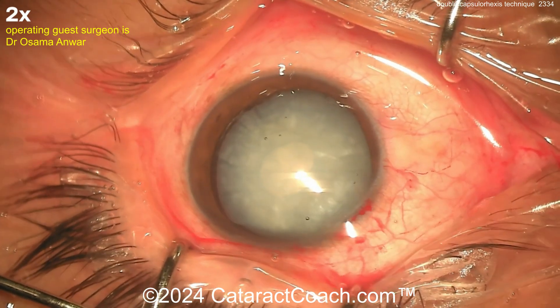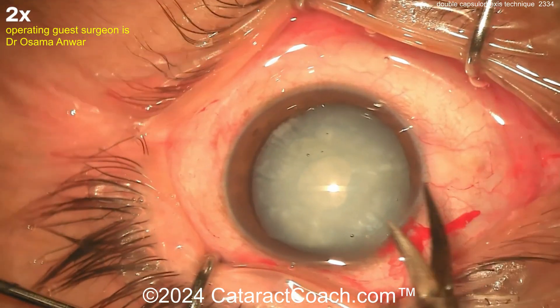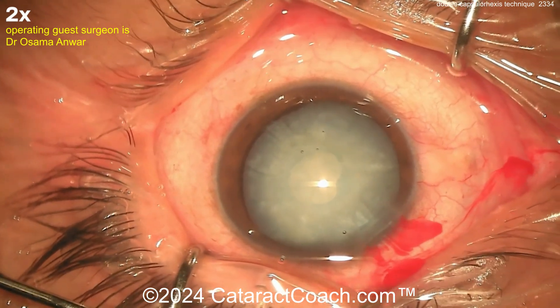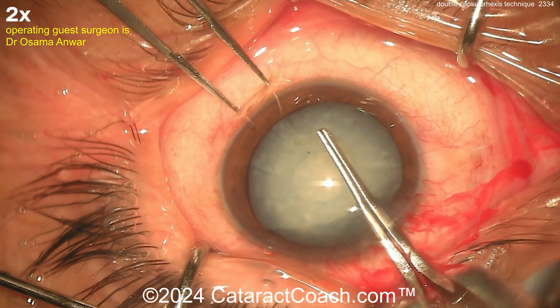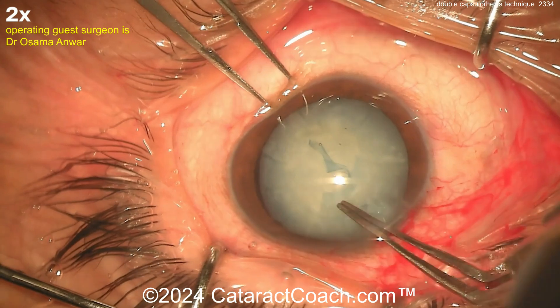Now you can put more viscoelastic in the eye, nick that, and start to get your big rhexis done. Using just the blade to widen up the incision a little bit, then using scissors — a little cut in the capsule. Now create your full-size ideal capsular rhexis of about five millimeters or so. Go inside, grab that edge you just cut, and get that going around — and that looks pretty good. Very nicely done.